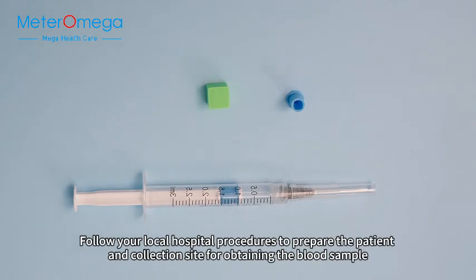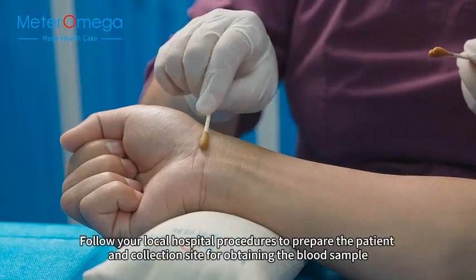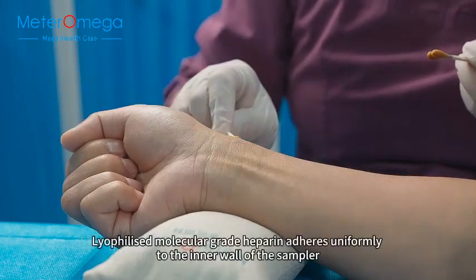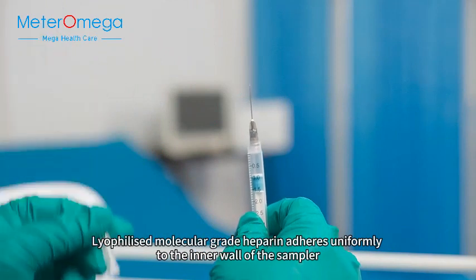Follow your local hospital procedures to prepare the patient and collection site for obtaining the blood sample. Lyophilized molecular-grade heparin adheres uniformly to the inner wall of the sampler.